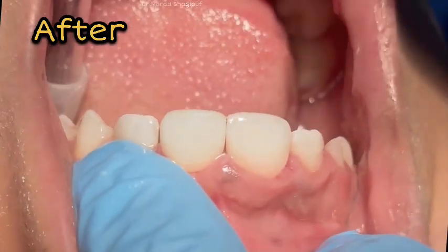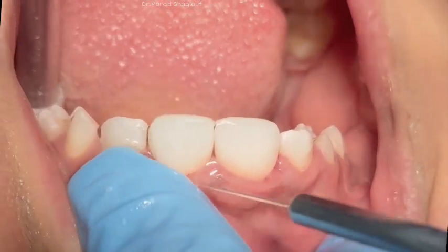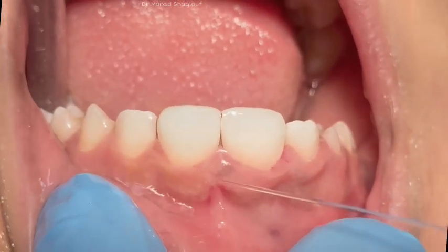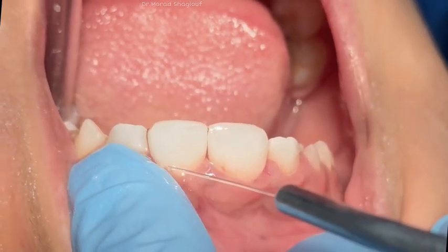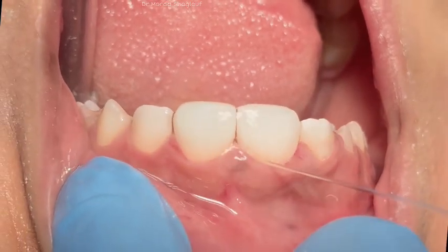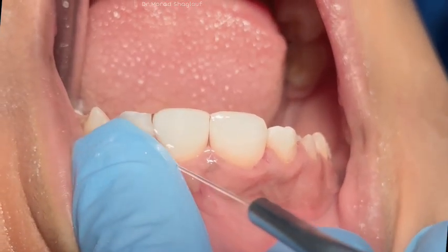This is a last resort for highly resistant cases, targeting the nerve to the mylohyoid, which can occasionally provide sensory innervation to lower molars. Use a brand new 30-gauge needle and 2% lidocaine, discarding the needle immediately after the injection to minimize the risk of needle tract infections or hematoma.